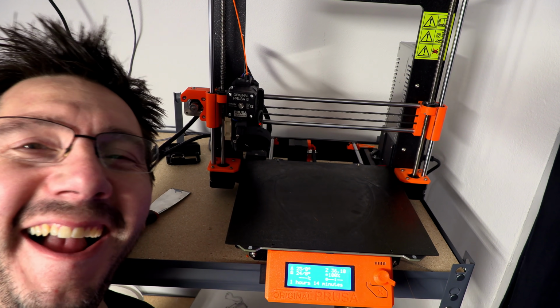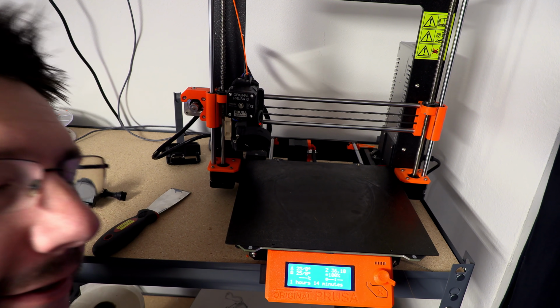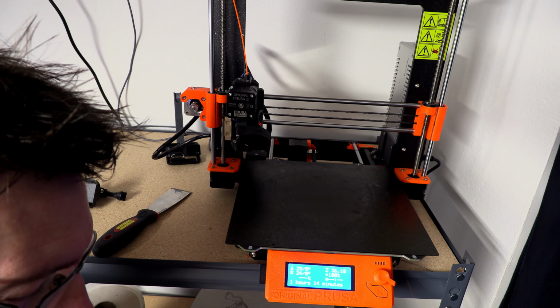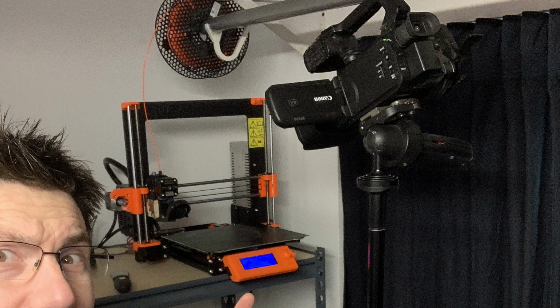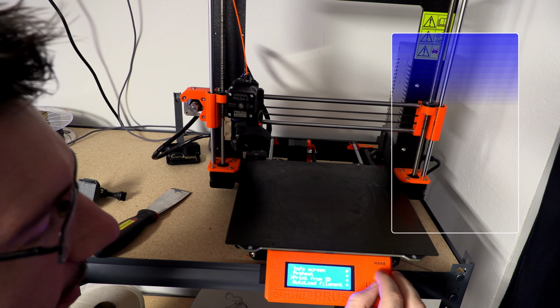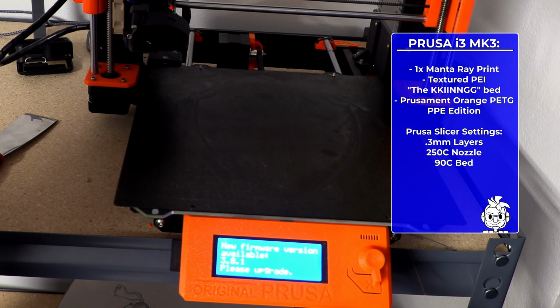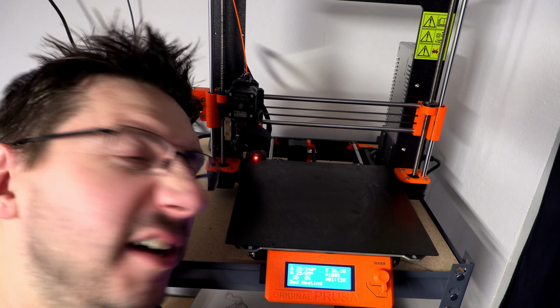Here we are at this superb camera angle. Look, in fact here, I'm going to get you a picture of how this camera is all set up, and then you can tell me what the heck. Here we go. This is a Prusa Mark III. So this is PETG, and it's got a flex plate from Printed Solid from The King in Canada, I think it is. This one, I just go here, I go all the way down, and I click, and then I get the familiar message that the firmware needs to be updated, but we don't have time for that, so let's just print on.